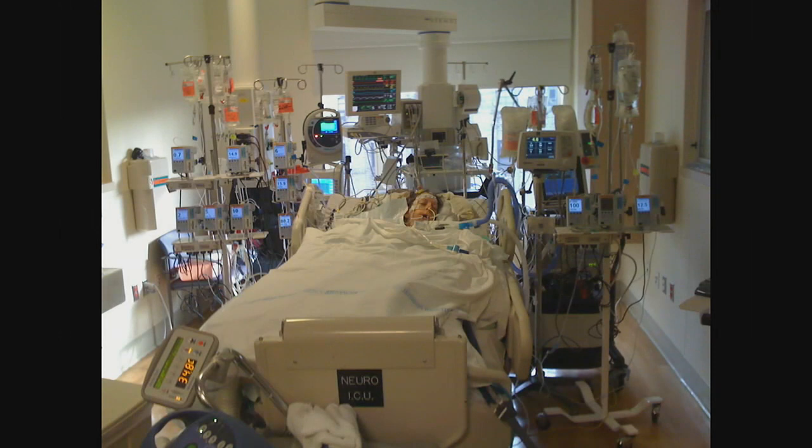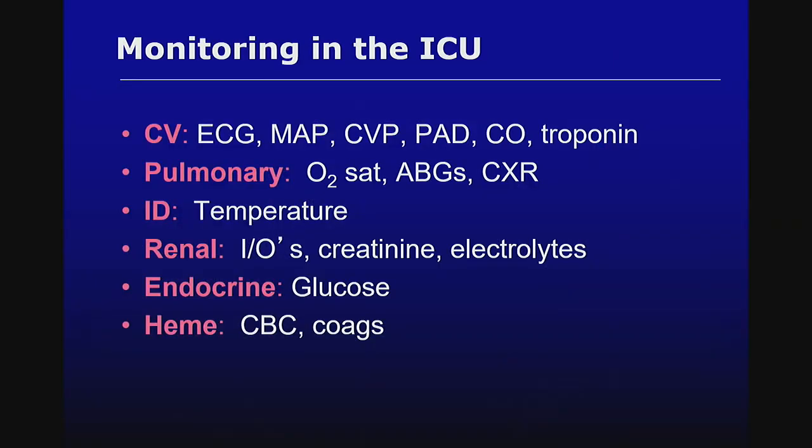And this is a woman in a coma. If you look closely, you can see what we affectionately call the bundle, 2 probes in her cranium, bringing a total of 5 different sensors into the brain to let us see what's going on. Because this lady is completely sedated, her EEG is quite flat, and she's fighting for her life. So we use these instruments as a gauge so that we have real-time information about the physiology of the brain.